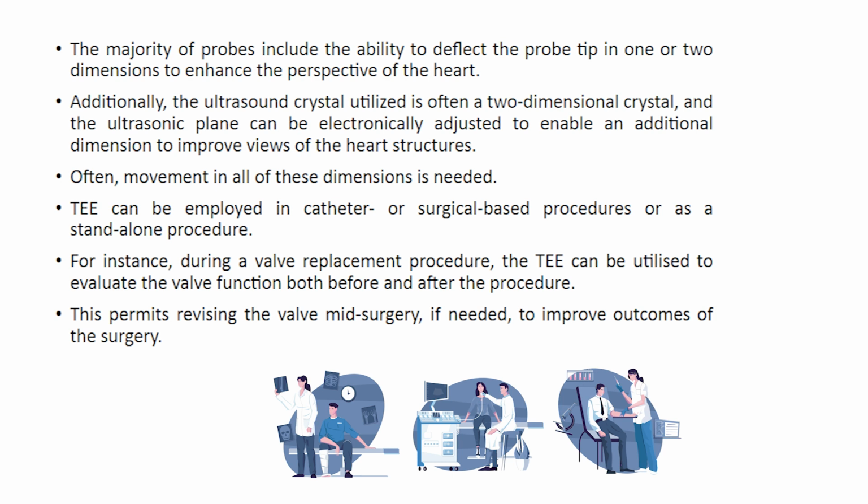TEE can be employed in catheter or surgical based procedures or as a stand-alone procedure. For instance, during a valve replacement procedure, the TEE can be utilized to evaluate the valve function both before and after the procedure. This permits revising the valve mid-surgery if needed to improve outcomes of the surgery.